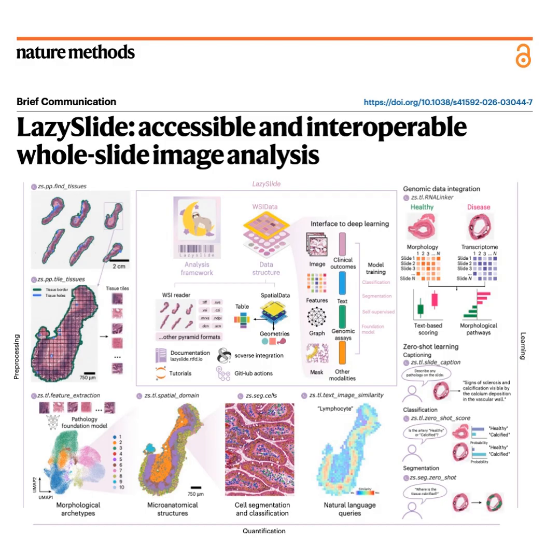So how does that actually work mechanically? If I type a word, how does it match it to an image? It uses something called cosine similarity. Think of it like a compass. Okay, a compass. When you type a word, say lymphocyte, the language model translates that text query into a dense vector, an arrow pointing in a highly specific direction in mathematical space. Got it. Now, the tissue image has already been translated into its own vector arrow. Cosine similarity simply measures the angle between those two arrows. Oh, I see. So if the angle is wide, there is no relationship. Right. But if the angle is incredibly narrow, meaning the arrows are pointing in almost the exact same direction, it means the visual tissue is highly correlated with your text prompt.